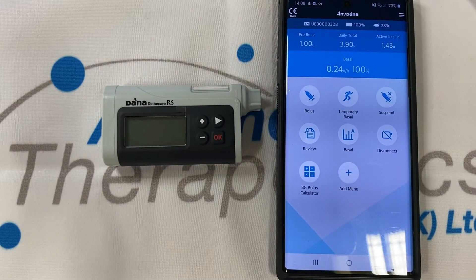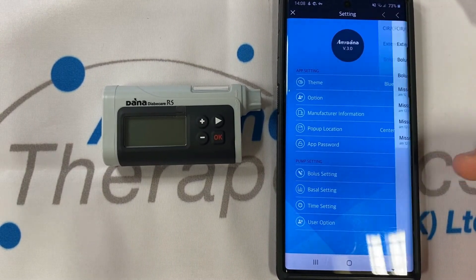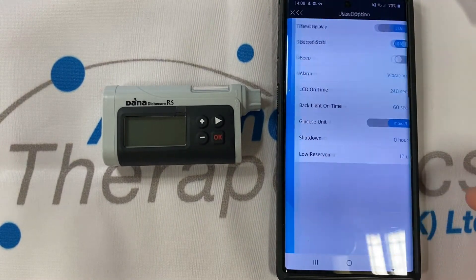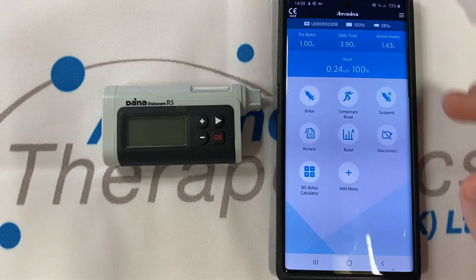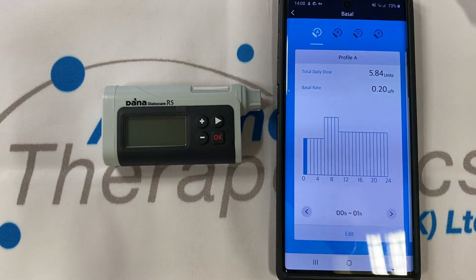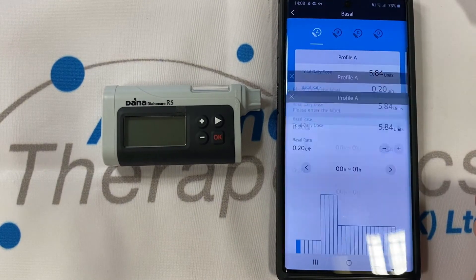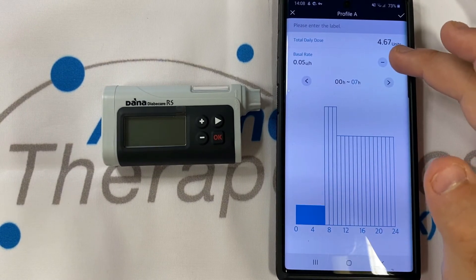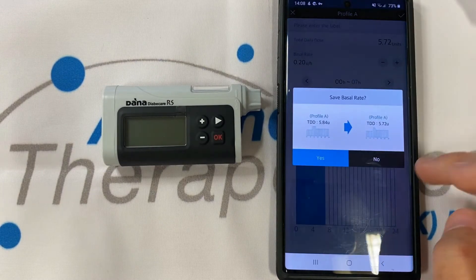But that's not all you can do on the phone — there's plenty more options. The menu in the top left will take you straight to things like your bolus settings where you can program in your ratios. You'll also have your user options to make changes to any settings on the user side. As well as being able to manage your basal rate — within basal you can slide between different profiles or edit profiles as you're running them. Tapping on edit will allow you to select your number range and use the plus and minus keys to make adjustments. Save these changes by tapping the tick and confirming.